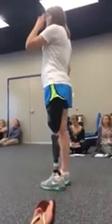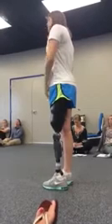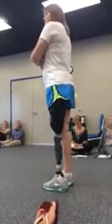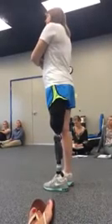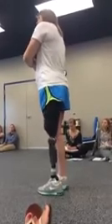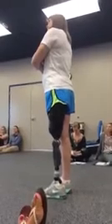We're gonna try to lay down a 12-inch roller between the heel and the toe, just as a minimum. And in case you're wondering, if that doesn't sound very scientific, because that's not really what step length is, it's heel to heel, right? The thing is, number one, we're doing visual or observational gait analysis, so we're not gonna get very technical. But number two, your step length depends on what? How tall you are. In some cases, whether you're male or female, those are at least 2 of the variables.